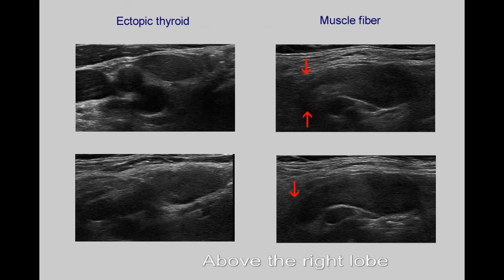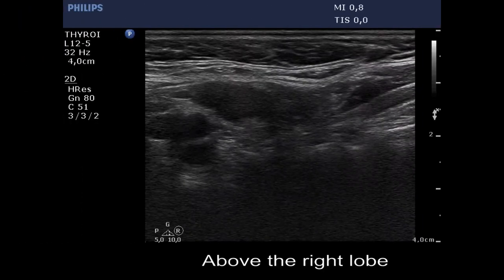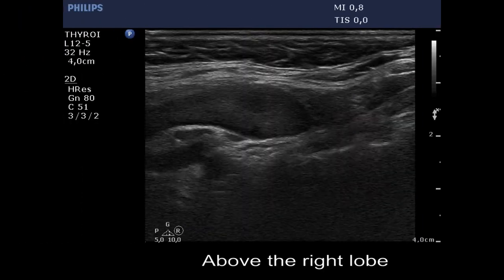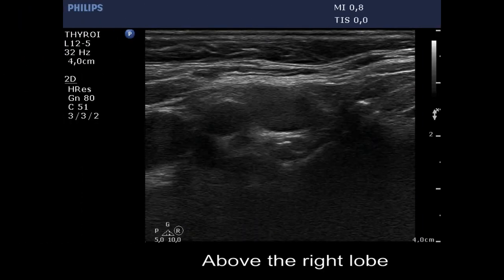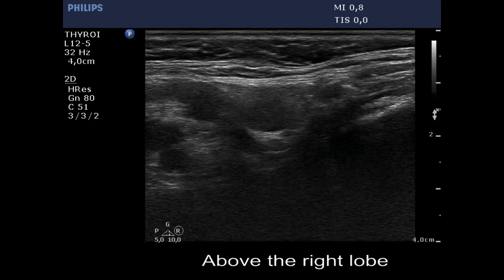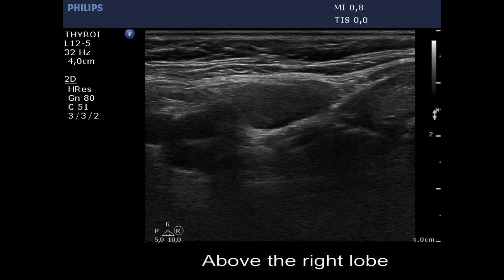Two hypoechoic lesions were found above the right lobe. The left one is a discrete lesion, while the right is a muscle fiber with a characteristic tail, marked with red arrows. We are above the right lobe — a muscle fiber with a characteristic tail and, now, the circumscribed, moderately hypoechoic mass.